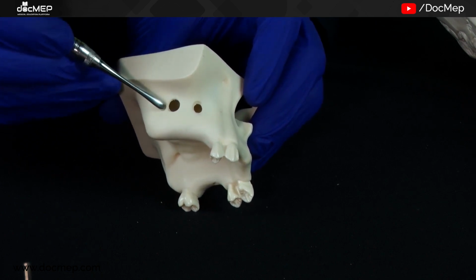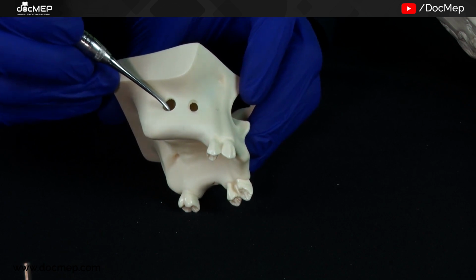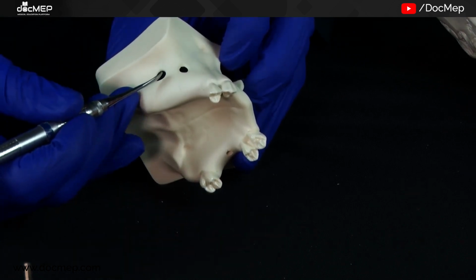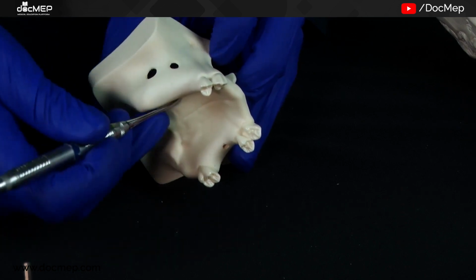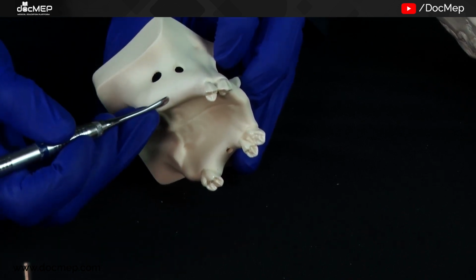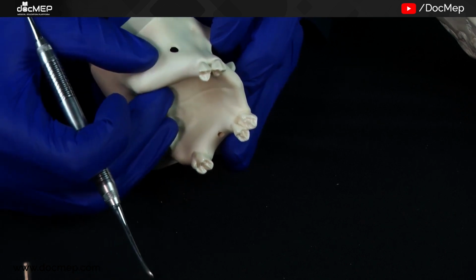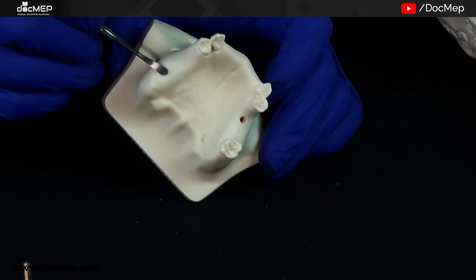So you open it laterally without perforating the sinus membrane, lift the sinus membrane, and put the graft from here till the palatal side. So the graft should be there from this buccal side to palatal side. So fill this completely. If 3 mm of residual bone is there, then you can do implant placement also at the same time, so that the healing time is reduced. Or you have to wait for 6 months for the graft to mature and then place the implant here.